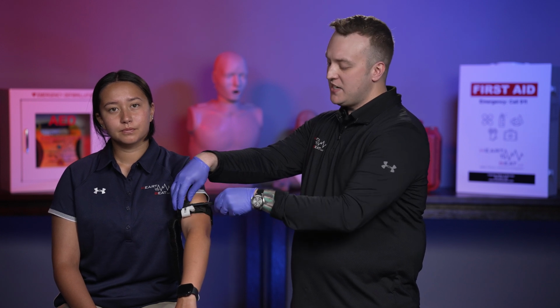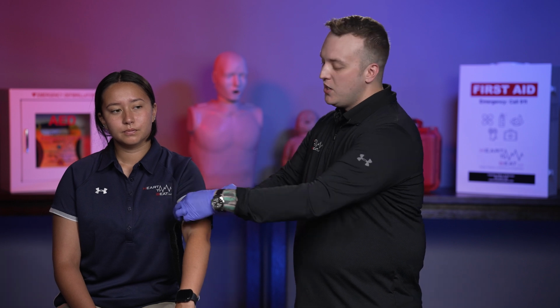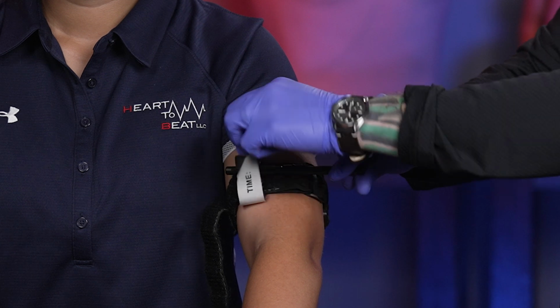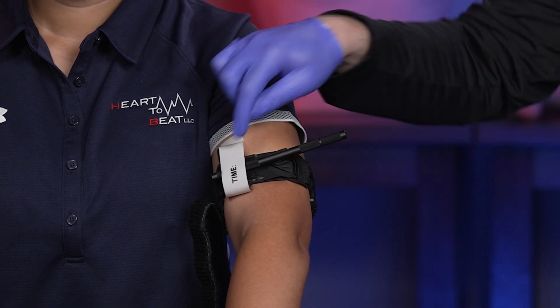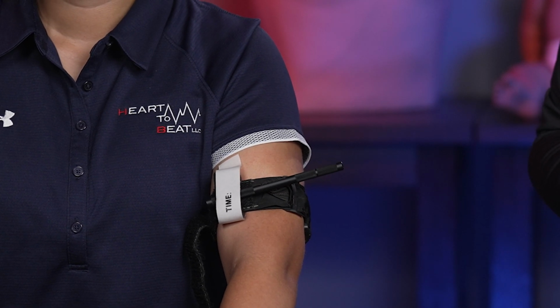Once we have that bleeding stopped, or as much pressure as we can possibly get out of tightening this, we're going to lock it down into these plastic pieces on the top and put the locking Velcro strap on top as well. On that Velcro strap, we have a spot to mark time for when that tourniquet was applied.